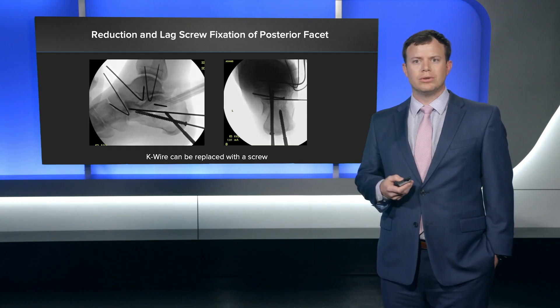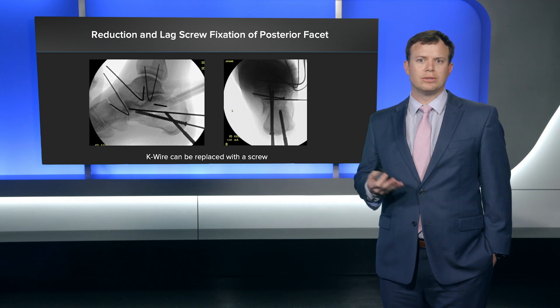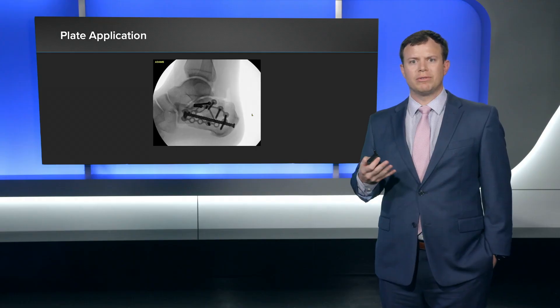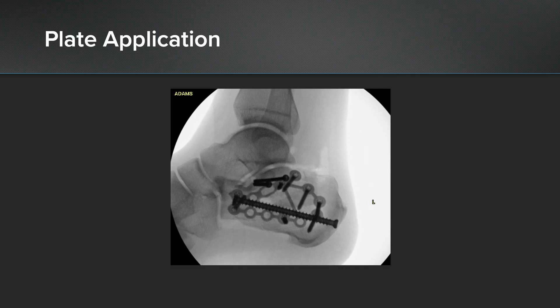A lot of times I'll replace the k-wire I put initially with another screw — for instance, you can use a 1.6 millimeter k-wire and switch that out to an Arthrex 2.4 millimeter screw. You can see the cannulated screw I also put along the medial column to maintain alignment in the Harris heel view. After I've got that reduction provisionally held with lag screw fixation of the posterior facet, that's when I start applying my plate. Here's the image after I've placed the plate.